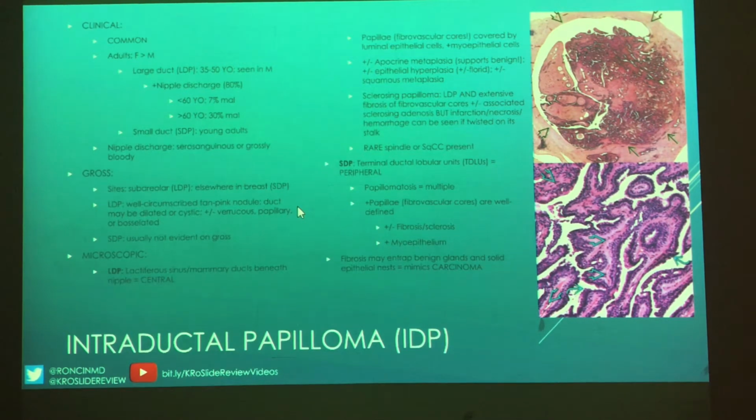Excellent. So obviously, as with all breast lesions, they're going to be more common in women than men. There is some slight delineation between the large duct papillomas and the small duct papillomas, but mostly it's where they are in the breast. If we think large ducts, you're thinking right at the nipple or right beneath the nipple, versus small ducts would be anywhere else. And your large ducts, because they're already in a large space, those ones you might see grossly, but maybe not. What else do I have in here? We went over everything about the large duct papillomas.